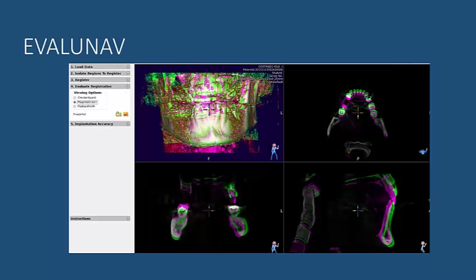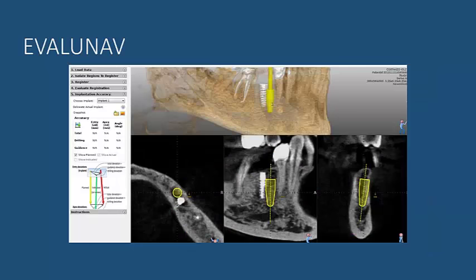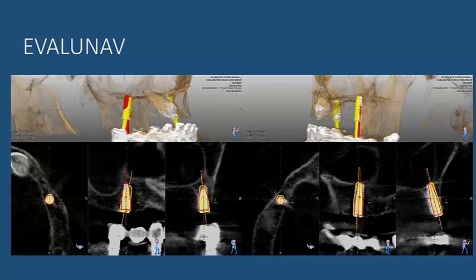The matching is carried out automatically but it can be improved, both automatically and also by the operator. That is an example of the outcome where we can see in yellow the shape where it has been planned and then executed, and also the quantification of the two.